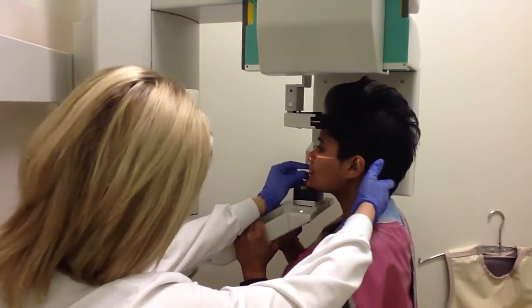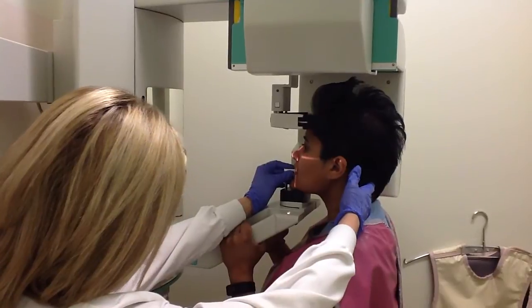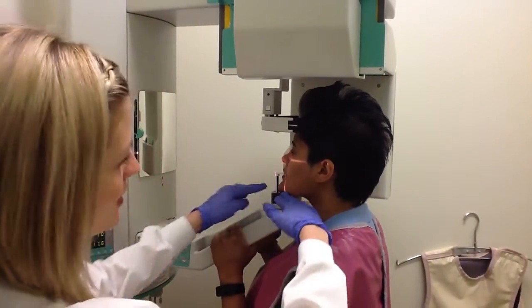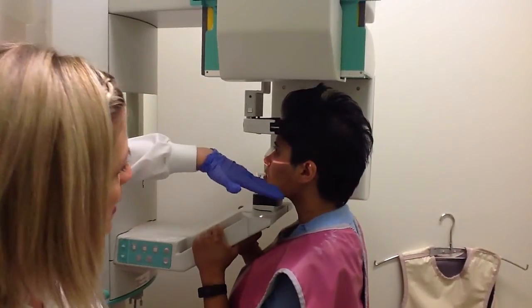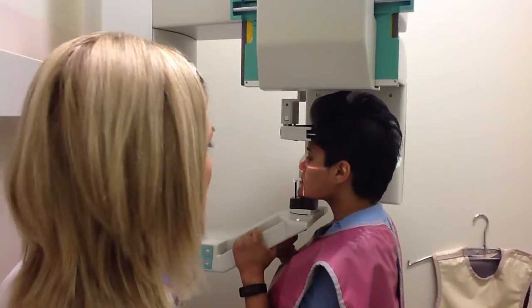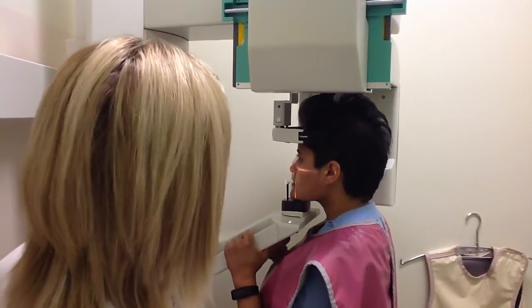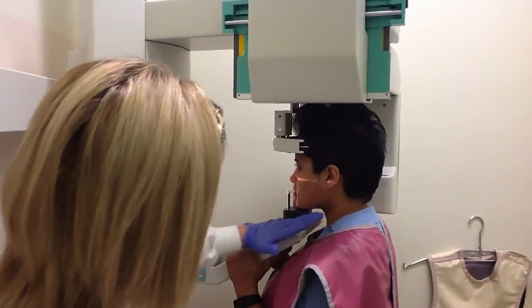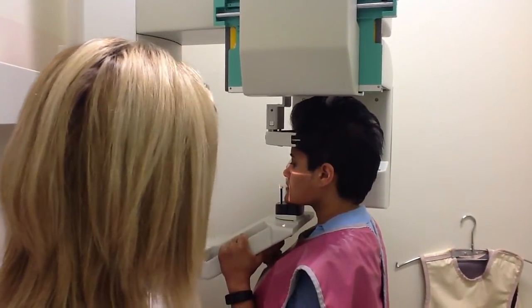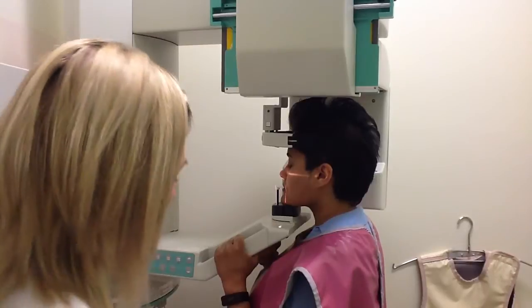Very good. So a little bit closer. Yep. Two front teeth groove. Great. Excellent. So it seems a little high. You can see our patient's chin is quite high. So we're going to lower the machine a little bit for their comfort and obviously for our positioning. So if I'm lowering, you can see now the patient's chin is a little too low. So I'm going to raise it just for comfort, and then we'll position her exactly how we would like.